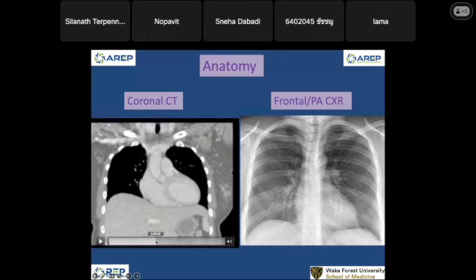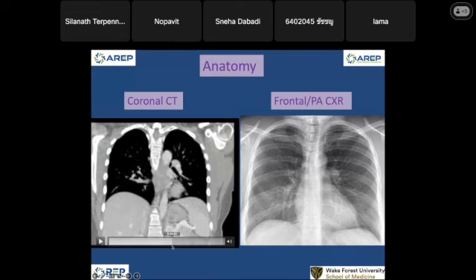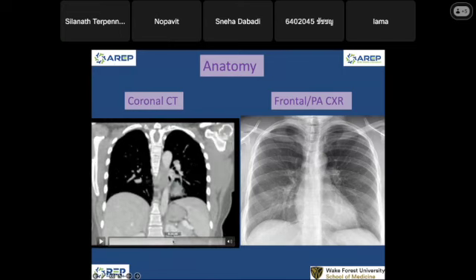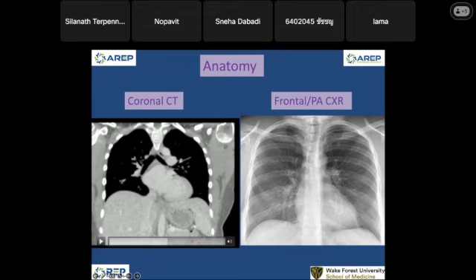The liver has dual blood supply. This is the portal vein. This is the main, and the left and the right portal vein. The liver looks good. And then you see, this is my descending aorta. The descending aorta comes down and supplies the belly. Okay, this is my spleen right here. And this is the stomach with the fluid.